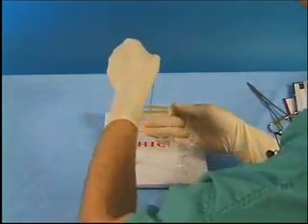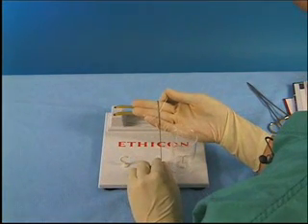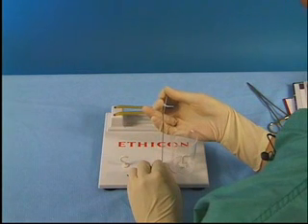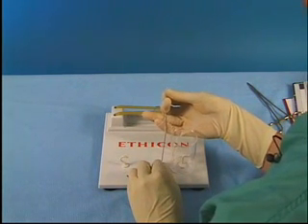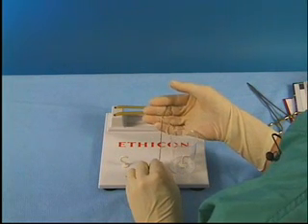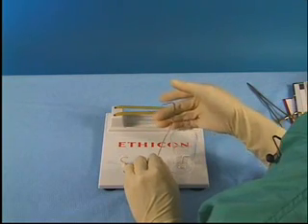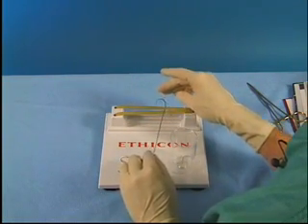The left hand is then brought from top to bottom, making an X across the 3 fingers. The middle finger is flexed and wrapped around the suture material that's held between the right index finger and thumb. This finger is then extended and the suture material is pinched between the 2 middle fingers. And as the hand is withdrawn, the material is drawn through the loop.